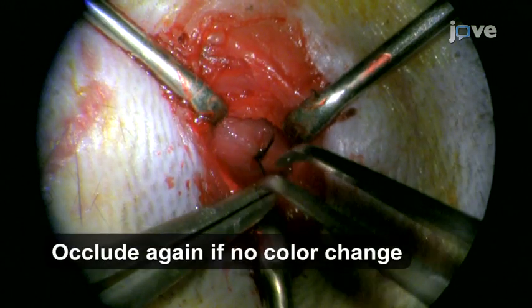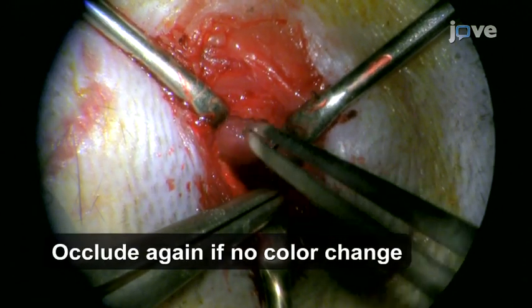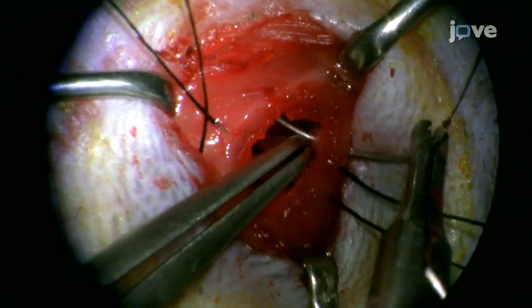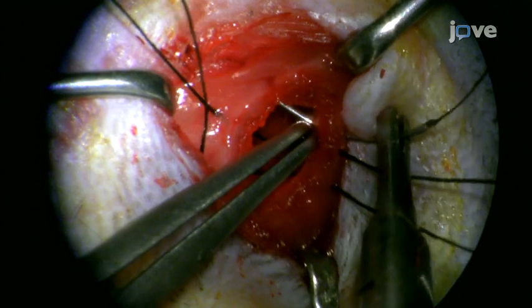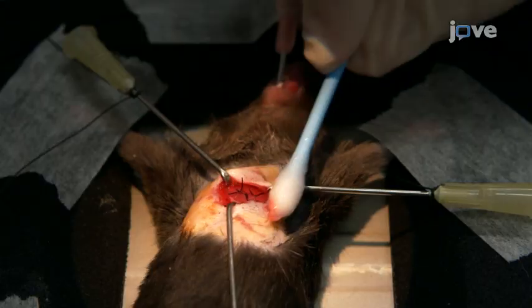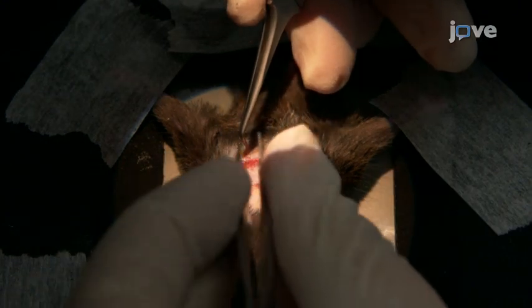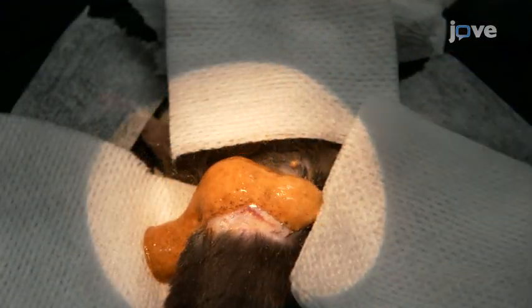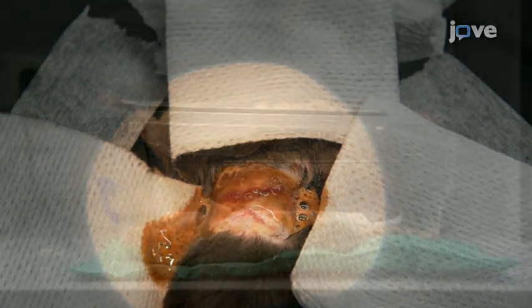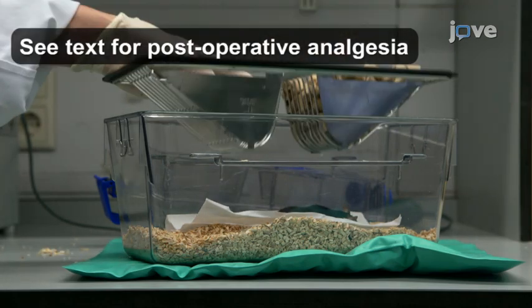After visually confirming the success of the infarct induction by the paling of the left ventricular free wall, carefully reinflate the lung and tightly close the chest with a 6-0 silk surgical suture. Clean the wound with saline and use more silk sutures to close the skin, followed by the application of wound spray to stimulate healing and to prevent infection.